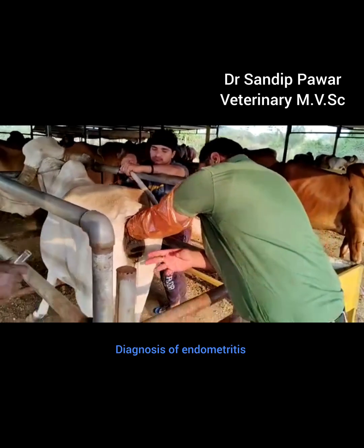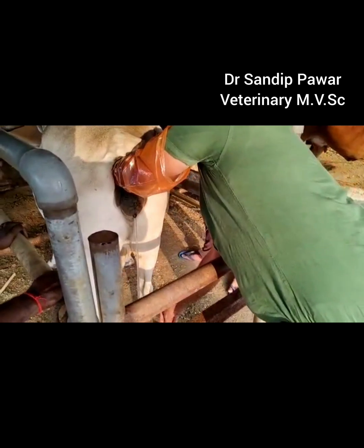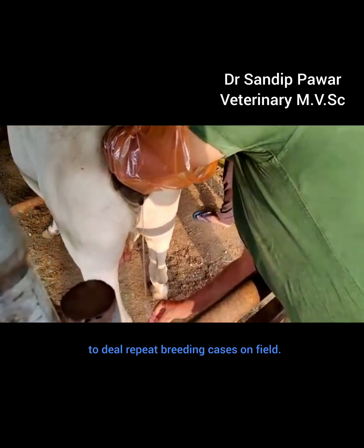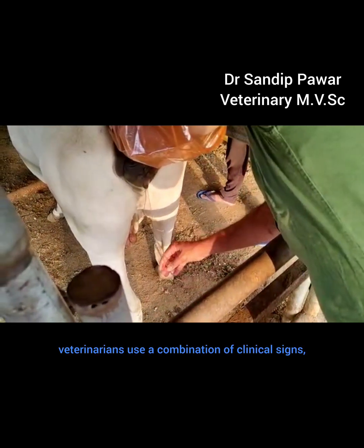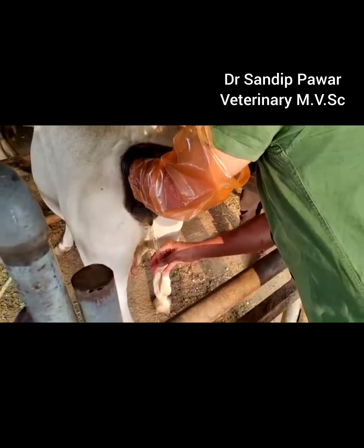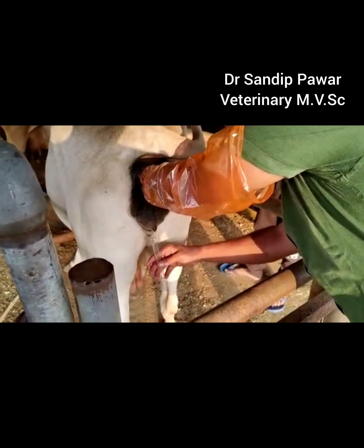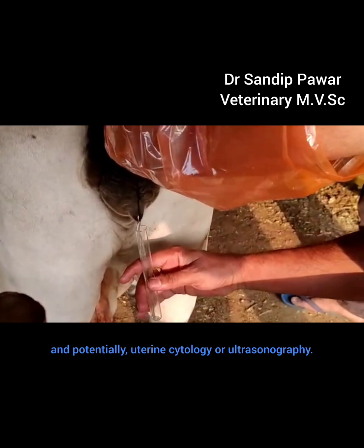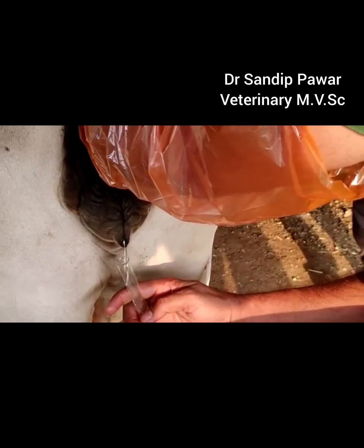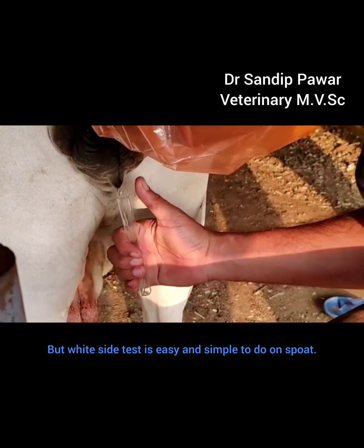Diagnosis of endometritis is a challenge for veterinarians dealing with repeat breeding cases in the field. Veterinarians use a combination of clinical signs, vaginal discharge examination, vaginoscopy, and potentially uterine cytology or ultrasonography. However, the white side test is easy and simple to perform on the spot.